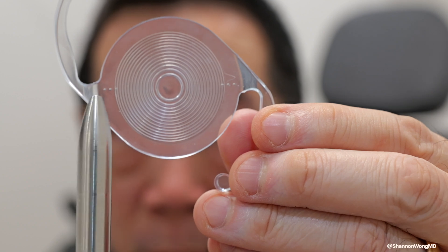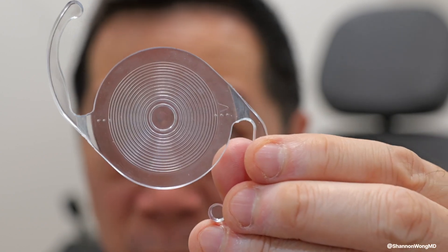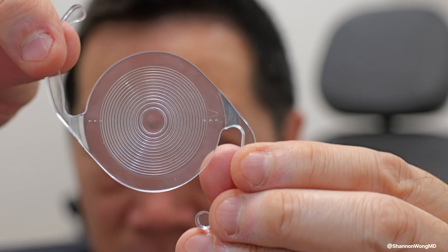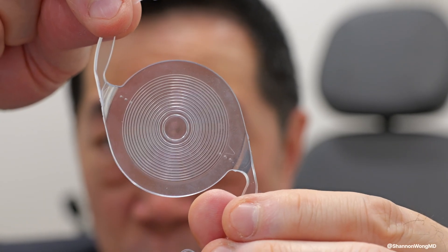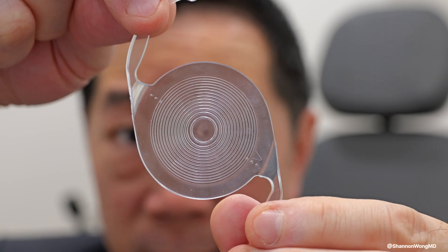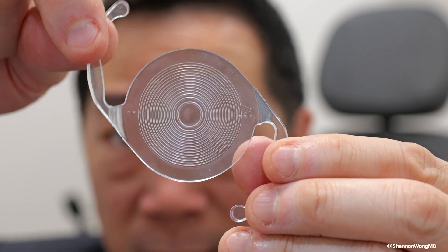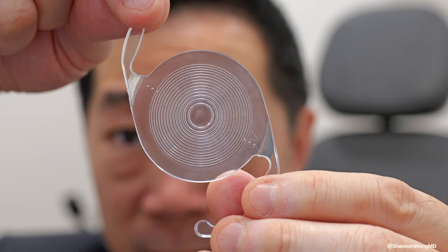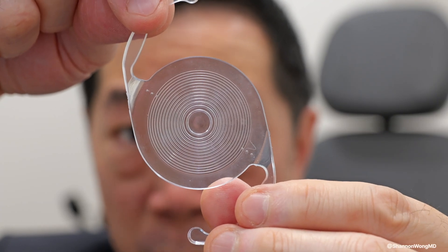This implant has a mark right here and right here that helps us to align it properly. If the implant is slightly rotated out of position, then that individual's vision will not be clear. And if the desired alignment is in one position and the actual alignment in the eye is in another position, then that patient will be blurry.